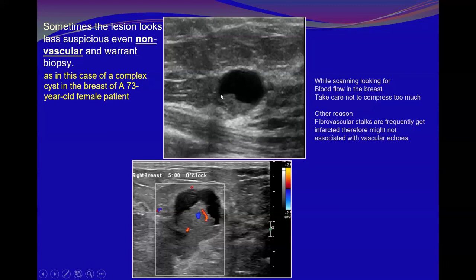Because it is lobulated. Usually the inspissated secretions, debris, and all other components and soft tissue within a cyst don't give a lobulated contour. This is one issue. The other thing is that it does not extend beyond the contour of the cyst. The cyst here is oval, but at the attachment of this tissue there is extension beyond the wall, and even some lobulations.